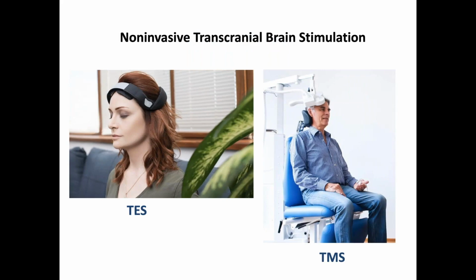So I would like to talk a little bit about transcranial brain stimulation or non-invasive brain stimulation. Transcranial by definition means that it's non-invasive because it's brain stimulation that you apply transcranially through the intact skull. And there are different technologies available that are transcranial and therefore non-invasive. I will focus on two technologies here. The one is TMS, here on the right.